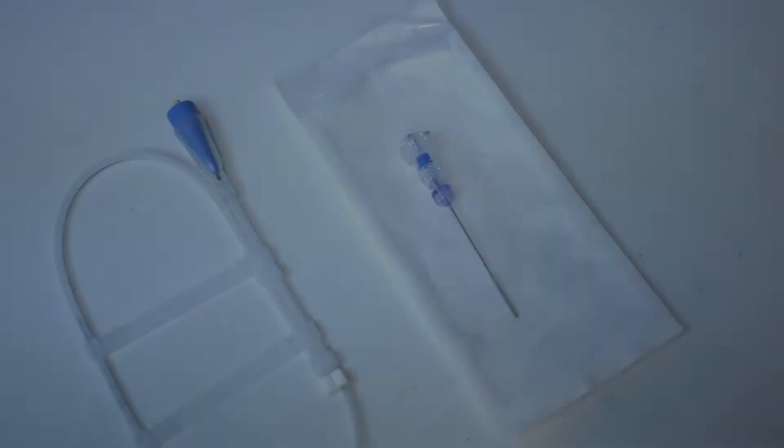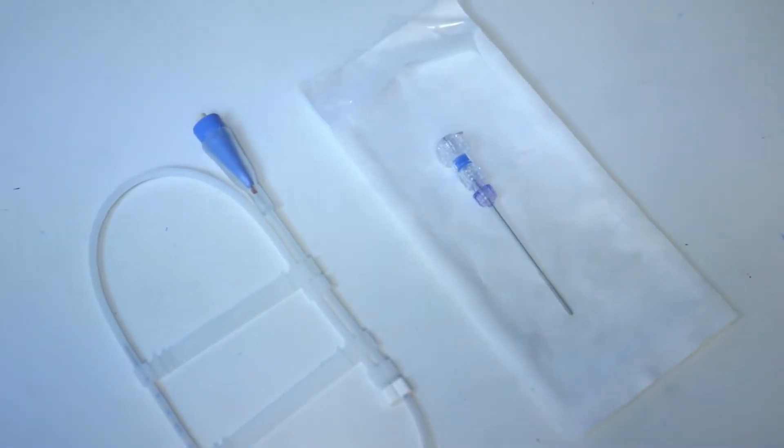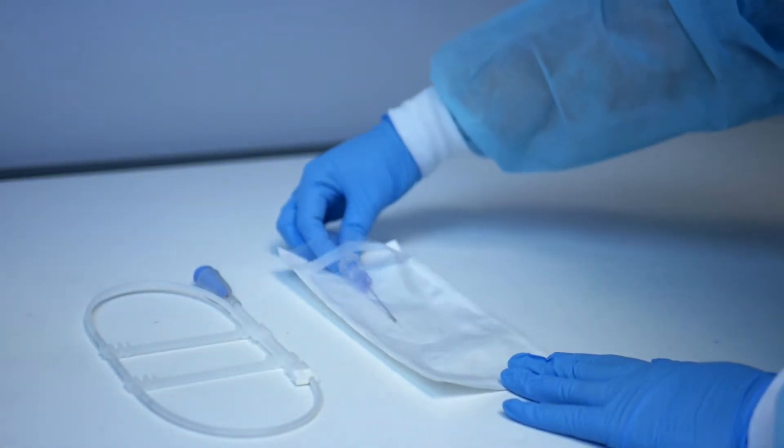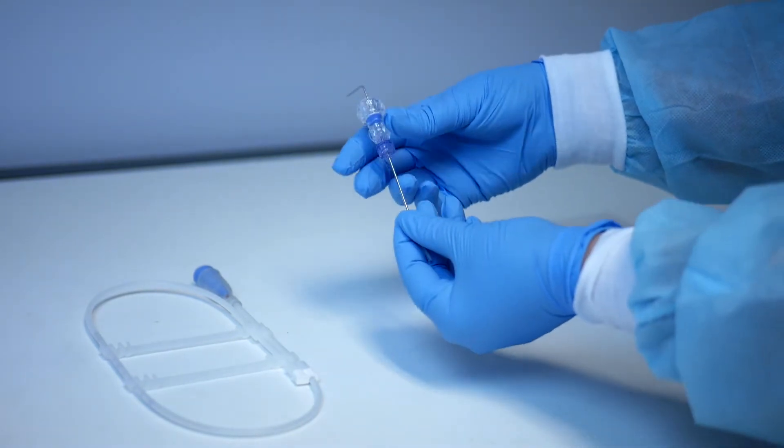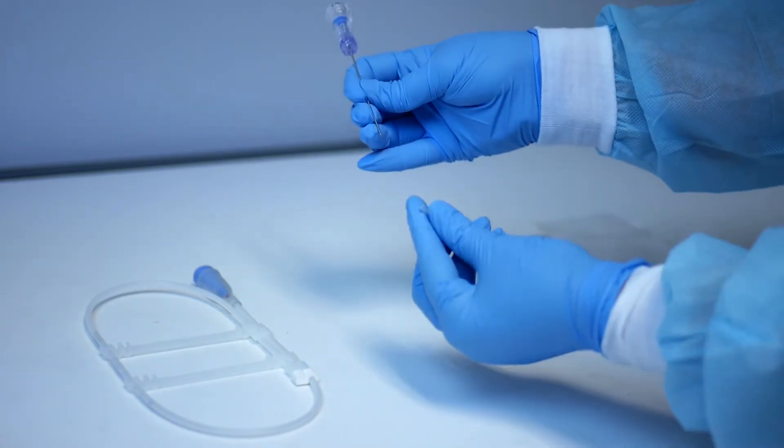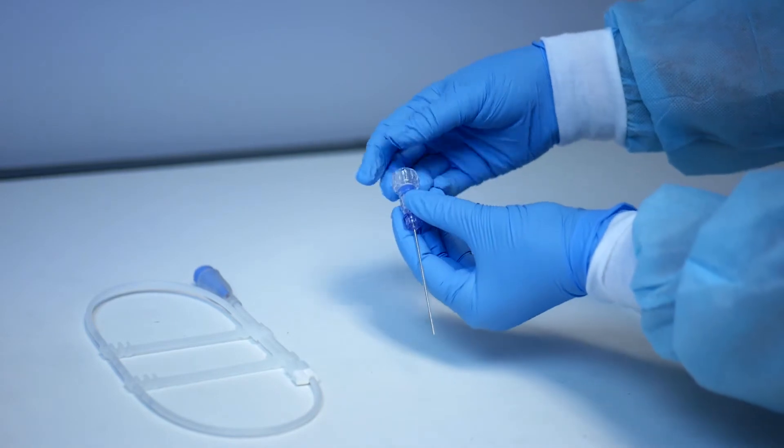Ensure you have both the Hemetix Q-Flow 500 Perfusion Probe and the Probe Durapiercer and Introducer Kit. Remove the Probe Durapiercer and Introducer from its packaging. Remove the silicone tubing at the end of the Durapiercer. Remove the Durapiercer from the assembly and set it aside to be used later on.